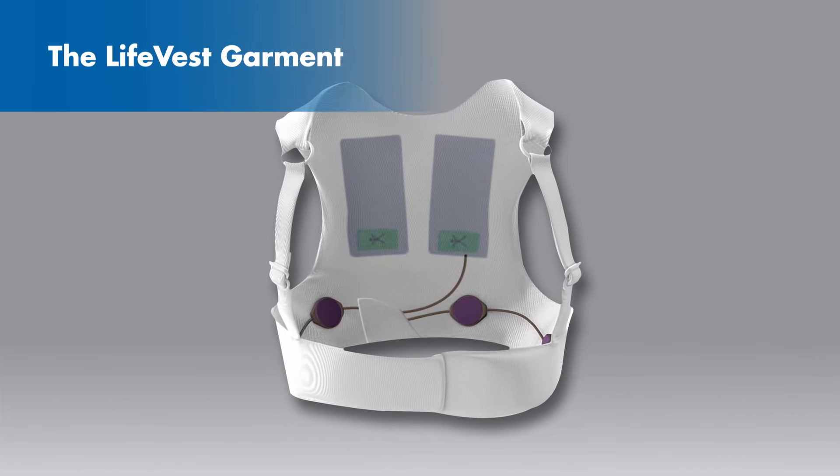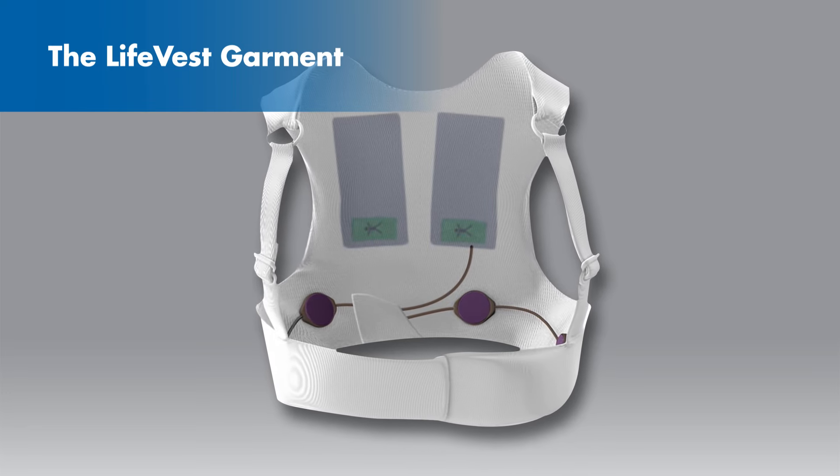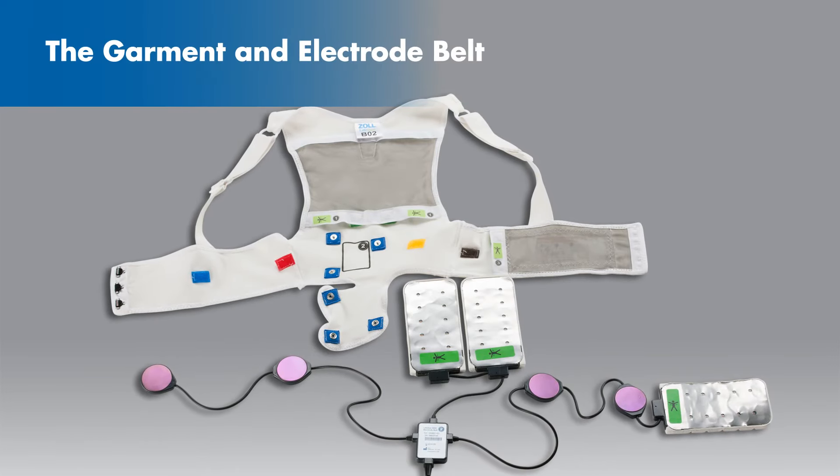In order to make sure that you are always protected, it is important that you assemble and wear your Life Vest as instructed. We will now review how to put together the electrode belt and the garment.